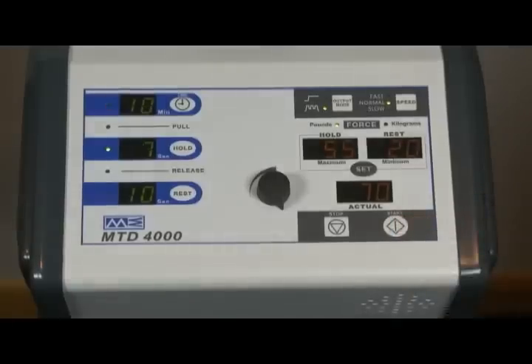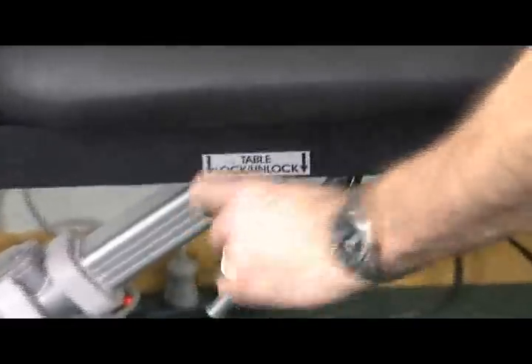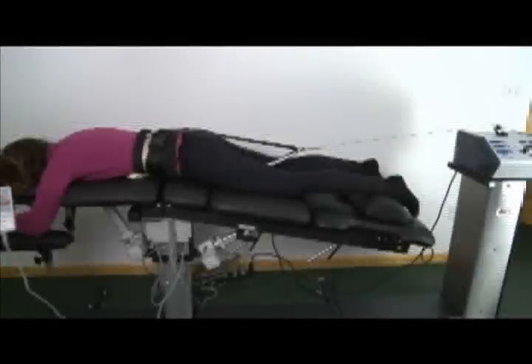Choose an appropriate KDT protocol and initiate the pull. Always allow the decompression drive to pull through one cycle of peak force and then rest before unlocking the table during the first rest phase. This ensures that all the belt slack is completely removed.